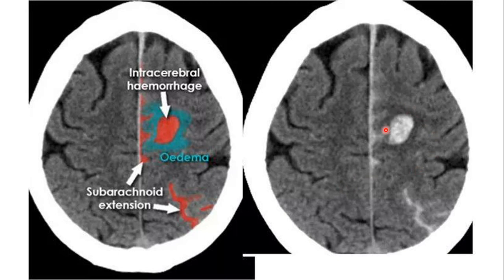There is an intraparenchymal hematoma with surrounding edema causing mild mass effect, extending into the medial aspect of the left cerebral hemisphere with increased density between the sulci. Comparing adjacent sulci, you can see increased density indicating extension into the subarachnoid space, causing subarachnoid hemorrhage. There is subarachnoid bleeding extending along the falx cerebri on the left side and into the overlying cerebral sulci.